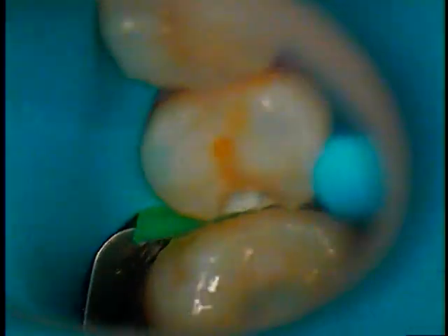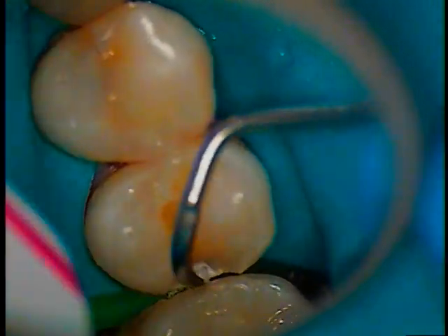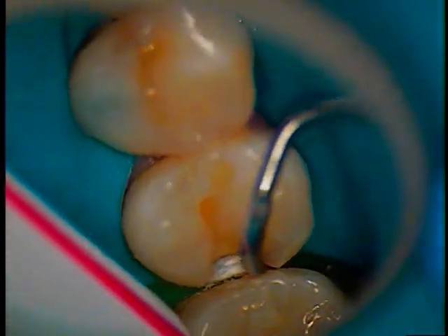Okay. Evan, you're going to feel a little pressure, okay, a little vibration, all right? And then we're cleaning off the adjacent tooth. We'll use the scaler for that. Okay. All right. There we go. That's the outline. Let's get rid of the decay.